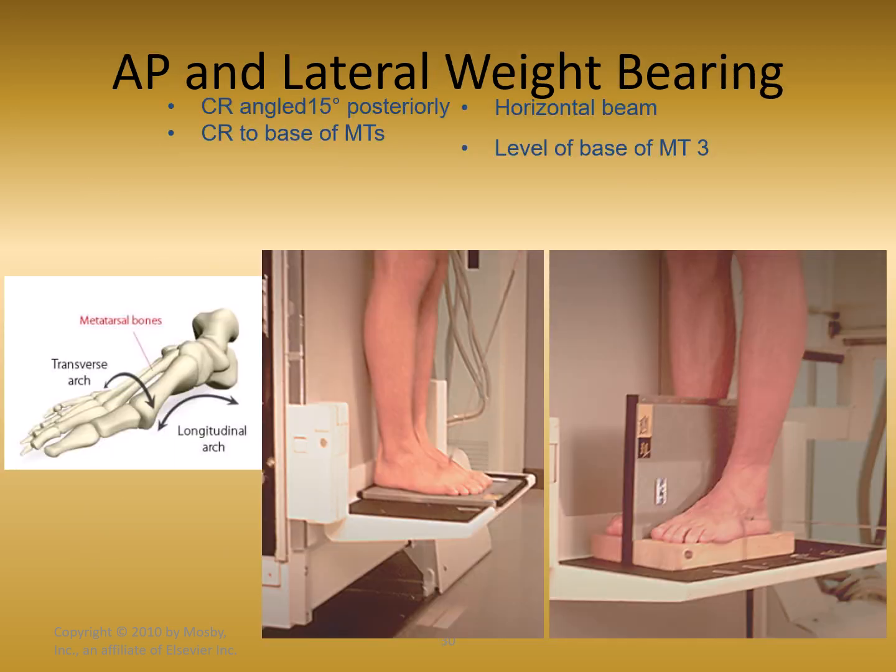Okay, so this first image is the AP weight-bearing foot, and this is the lateral weight-bearing foot. On the AP, notice there is an angle on the tube. It is a 15-degree posterior angle of the tube. Because why? Because we're working against that longitudinal arch of the foot. We're trying to go through those joint spaces.